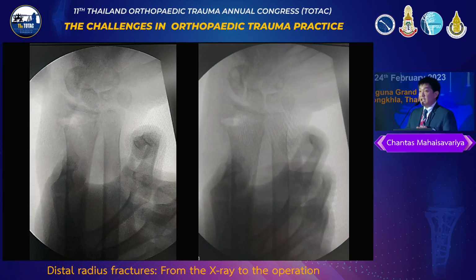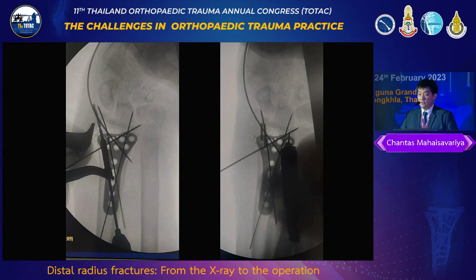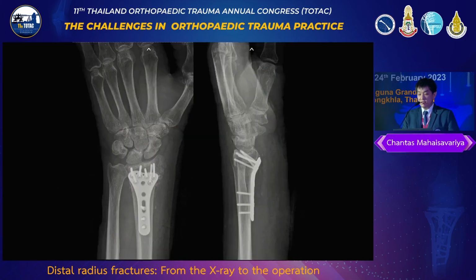When I operated on this case, when I opened it, I saw the callus. So that means this injury may be about 2 or 3 weeks old. After I cleared the callus, there is a void, as you see here. So I do the same thing, use the K-wire manipulation, and I flip the wrist into ulnar deviation, and I use this K-wire to maintain that this fragment doesn't have any translation at all. I put the bone graft to fill the space. I drilled it and finished it like this.